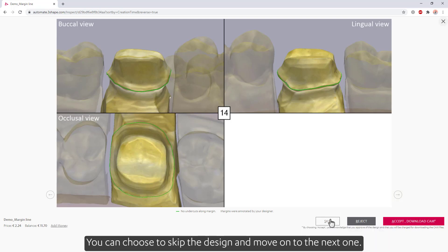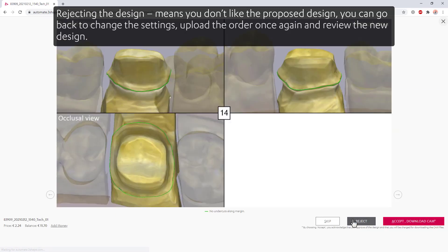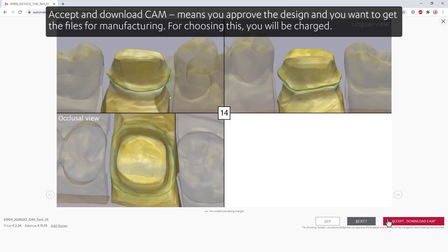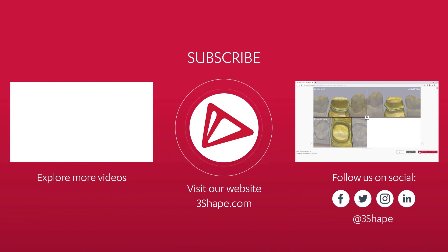You can choose to skip the design and move on to the next one. Rejecting the design means you don't like the proposed design — you can go back to change the settings, upload the order once again, and review the new design. Note: you won't be charged if you choose one of those options. Accept and download CAM means you approve the design and want to get the files for manufacturing. For choosing this, you will be charged.